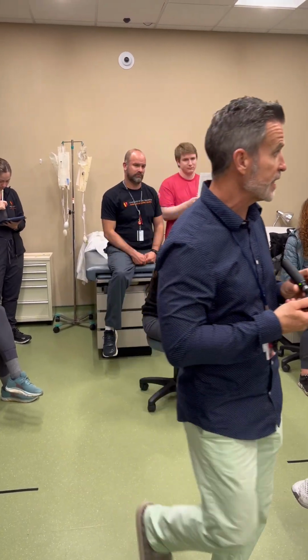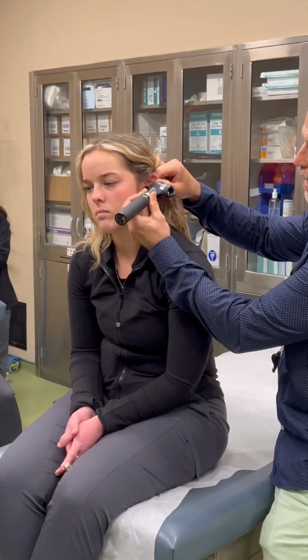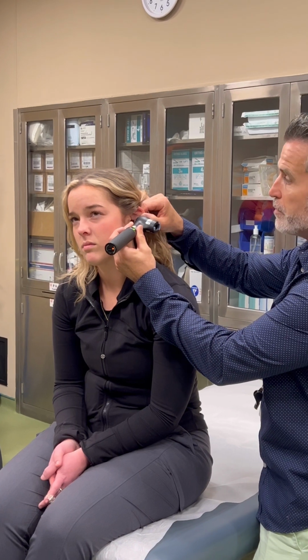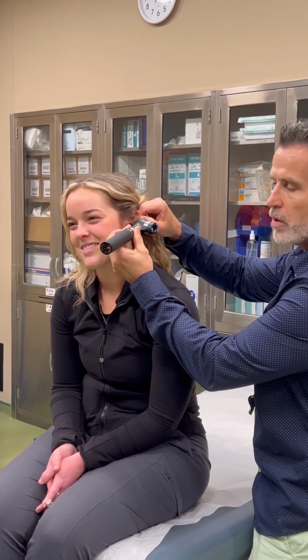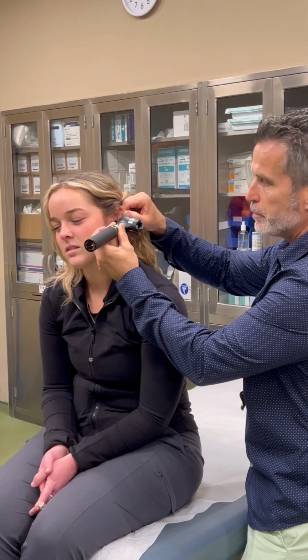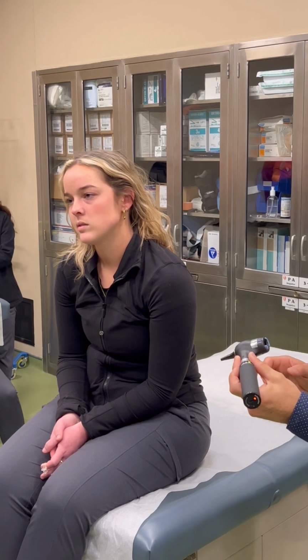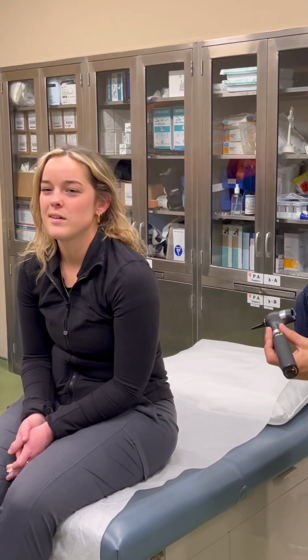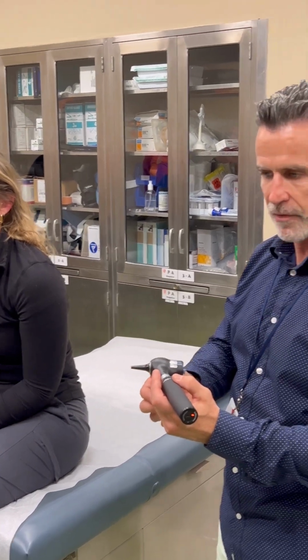The other big thing that you guys can't do today, because your partner's going to be mad at you, notice when I go in, I'm right there, that's it. I'm not way in here. Look at her face, see? That doesn't feel comfortable. You just need to go in far enough for that to get in and then manipulate the ear by pulling, and that's it. You guys are going to stick it way far in today, and your person's going to be like, oh, that hurts a little bit. And you're going to say, oh, I'm sorry. But I'm telling you now, just barely put it in enough, okay?